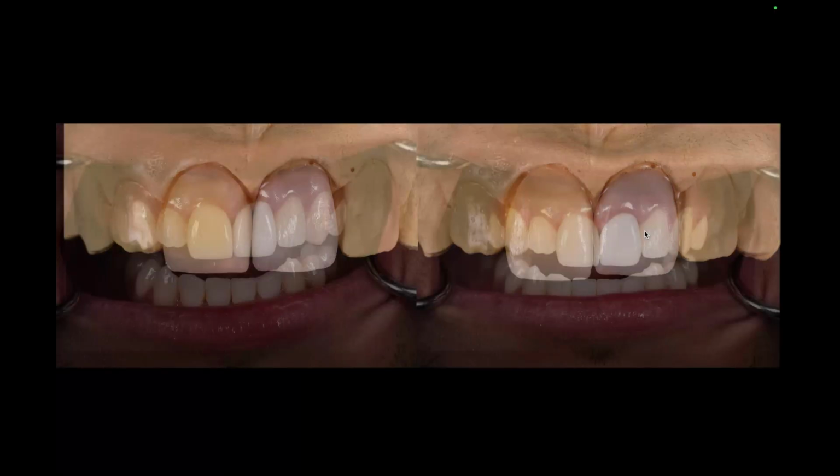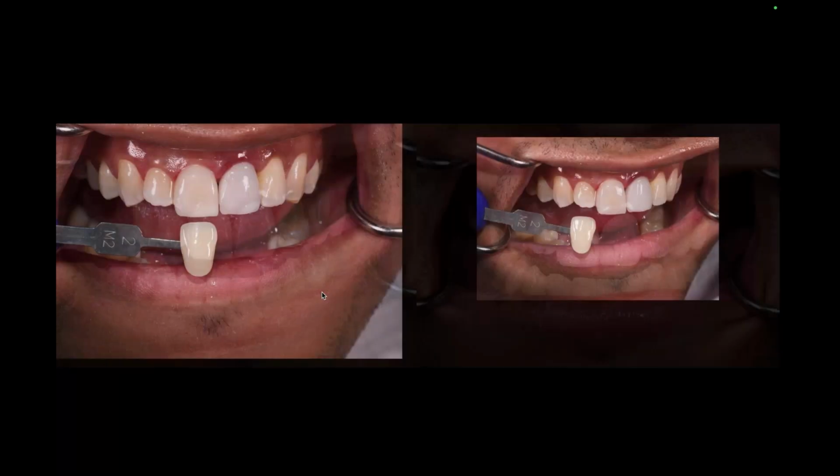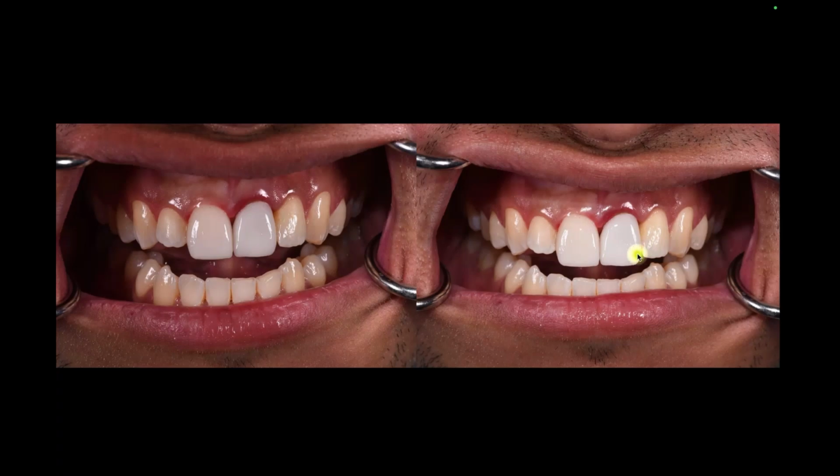So here's the try-in in the mouth. And you can see the doctor put the two restorations in. At this point, they don't look terrible, but I am seeing the grayness come through in the more translucent ingot. When I get to the more opacified ingot, it's not terrible, but come on, you can read that this is gray, right? You can definitely read that this is gray.